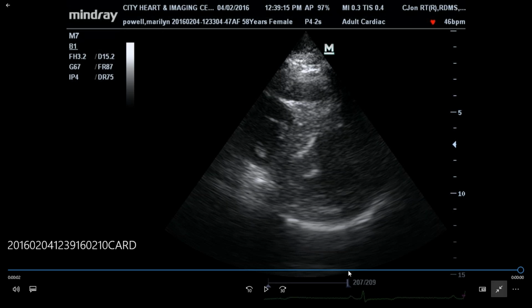So that is something that you do all the time. So if you're at the short axis at the level of the aorta, to get short axis, remember, from the position that your transducer is in to get your parasternal long axis view, you have to do clockwise rotation of the probe, and to get the short axis at the level of the aorta, you have to tilt the probe downwards. So the top of the probe, you're going to tilt it downwards, and then you'll get short axis at the level of the aorta. To get short axis at the level of the base, you have to tilt it up a little bit.